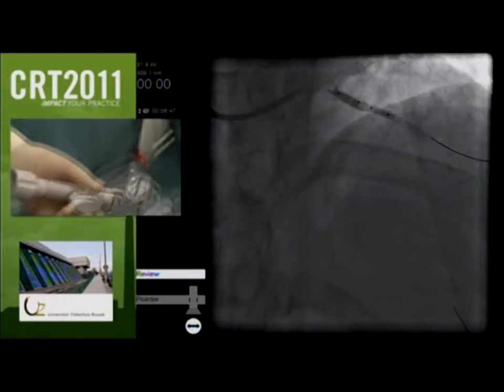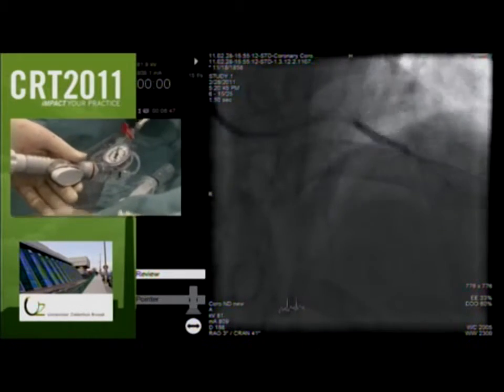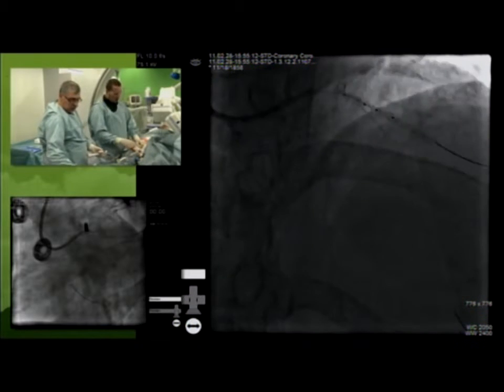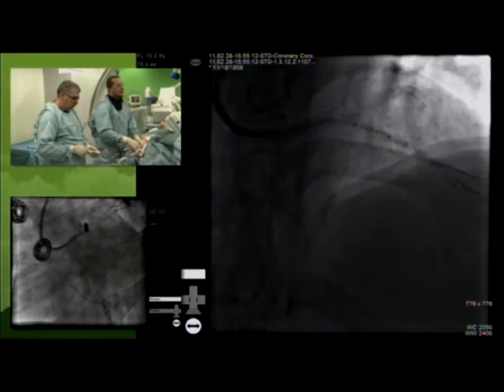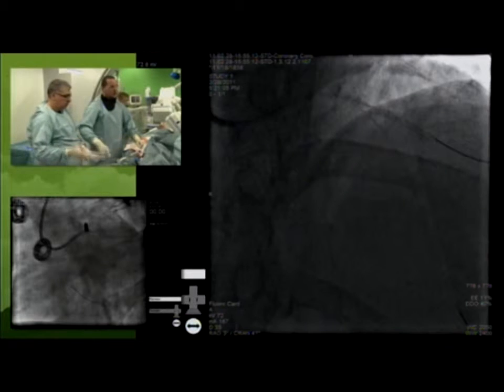As you can see, this is a stepped model. We have a 3.5 millimeter proximal size and a 2.5 going into the diagonal branch. And you see that the step down of the balloon size occurs within the transition zone, well opening your bifurcation towards the main vessel. Alles goed? So this is well deployed now. So this is a 3.5 that steps down to a 2.5.